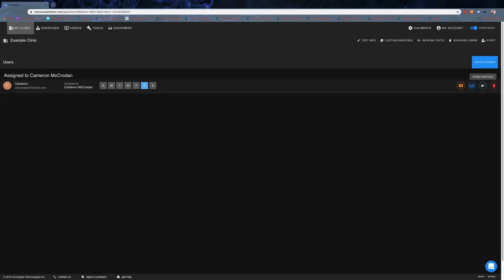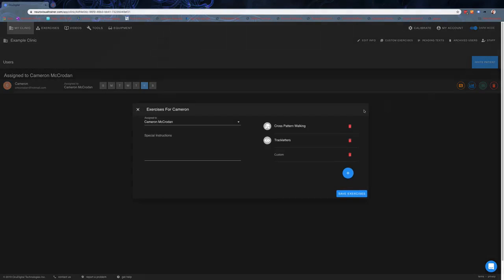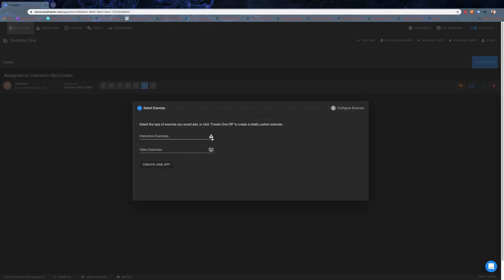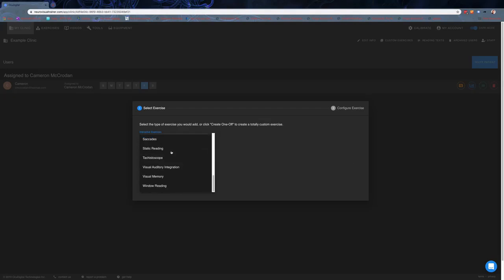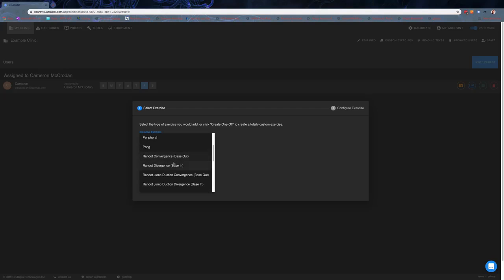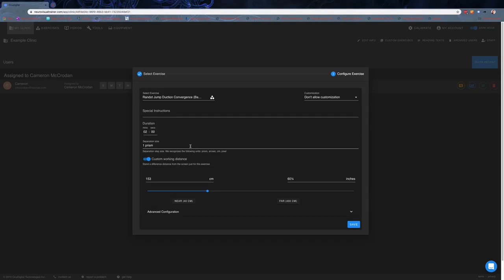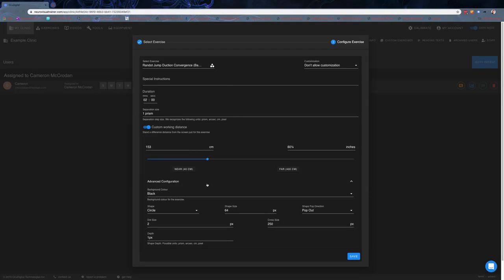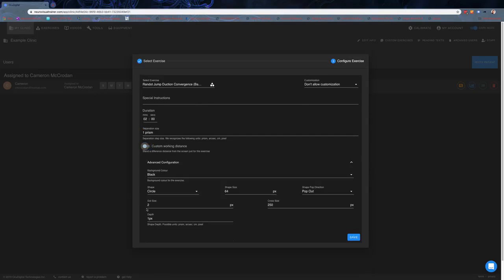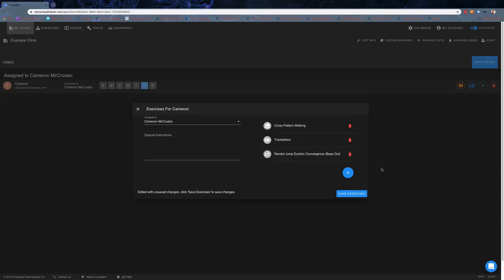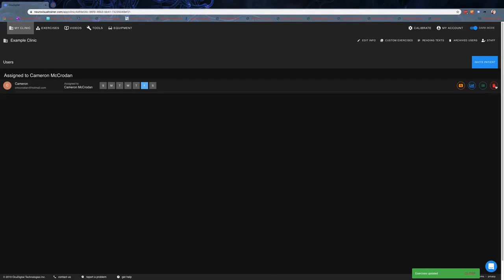The little green button here is for assigning exercises to the patient. You can choose what you're assigning to the person and give them special instructions that week. We can delete an exercise or add exercises, choosing from the list of interactive ones based within the computer program. For example, if we choose Randot jump ductions, you can put in special instructions, duration, prism work, prism size, separation, custom working distances, and even further advanced configuration. There's tons of flexibility, although it can also be kept very simple as needed. Once that's set up, you can save the exercises for that person.